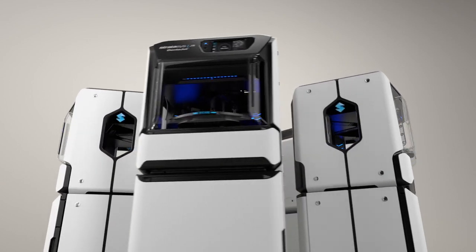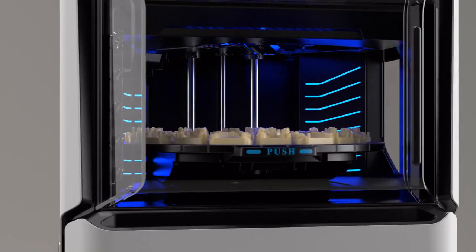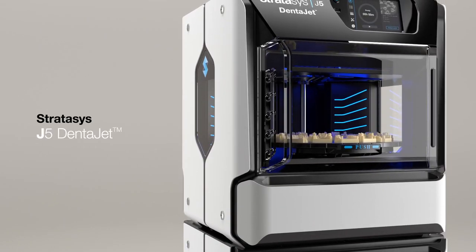All lab types, all in one tray, all of the time. The newest addition to the Stratasys Dental family, the J5 DentaJet is the all-around dental solution.